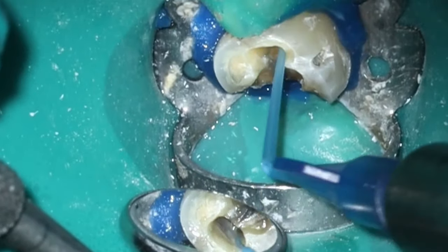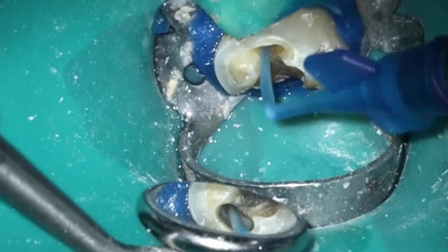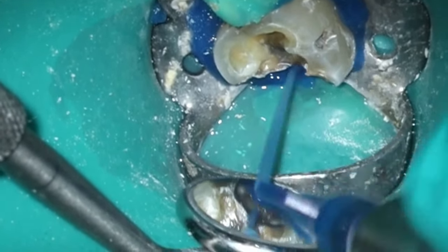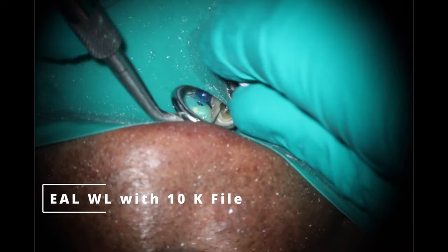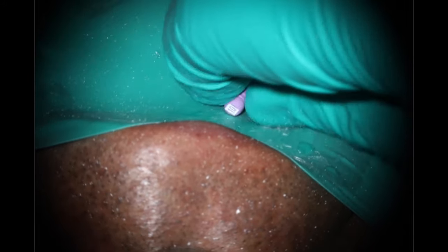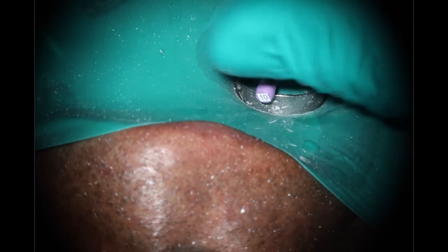You can see that stabilization kind of coming in there — that rippling effect. I'm still not sure if I like it or not, so let me know in the comments. Going to dry everything off. I did put a little too much block-out on the distal, so you'll see me cut that off in a minute. Going ahead and doing our working length just like normal, with the 10K file down to the bottom. I did have a little bit of struggle getting all the way down, so I'll check that in a bit. The mesials look good — getting those cleaned out.